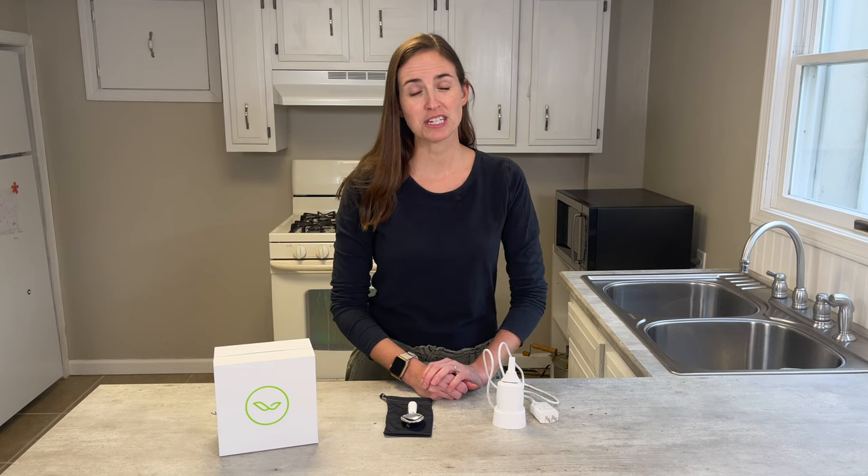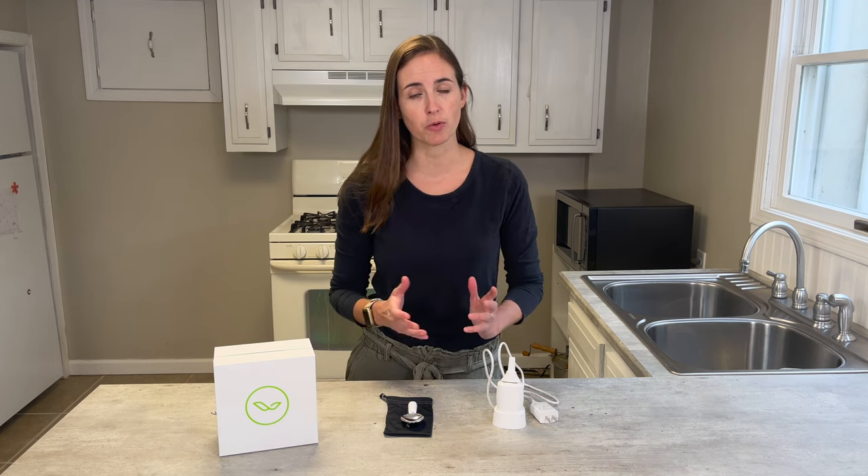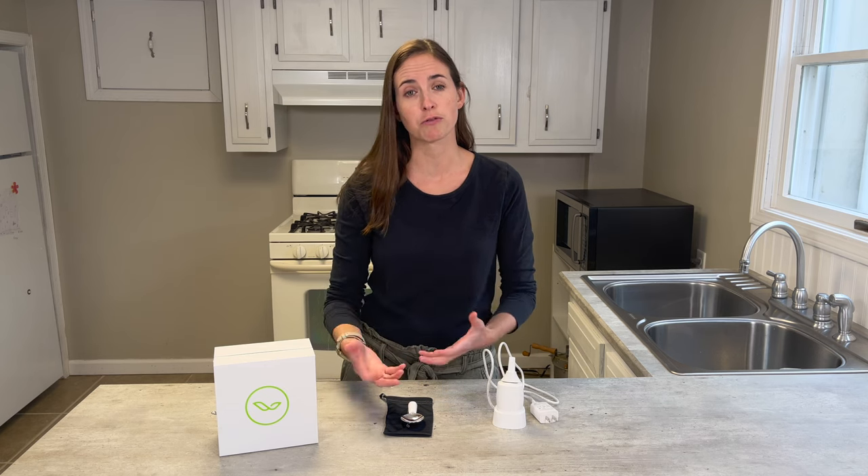Hi everyone, it's me Lindsay with EquipMeOT here today to talk about Liftware Silverware. This is a really interesting product. It was created specifically for individuals with tremors to help them complete self-feeding tasks without the tremors influencing how they're able to bring food to their mouth.